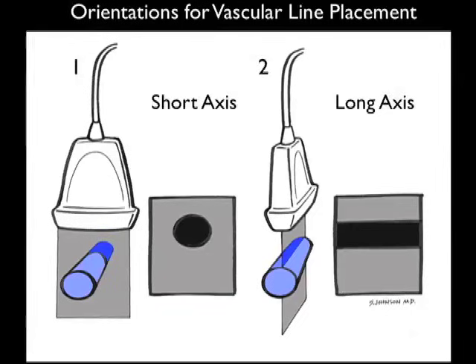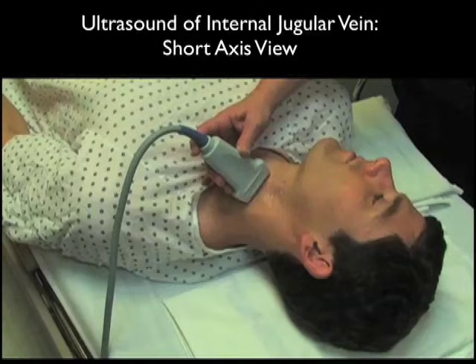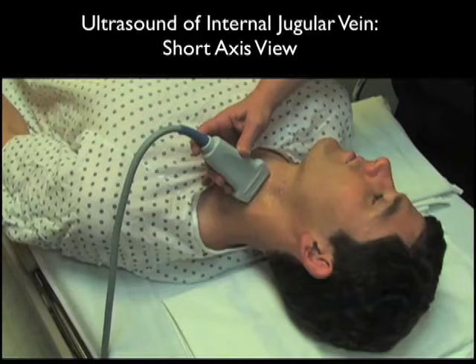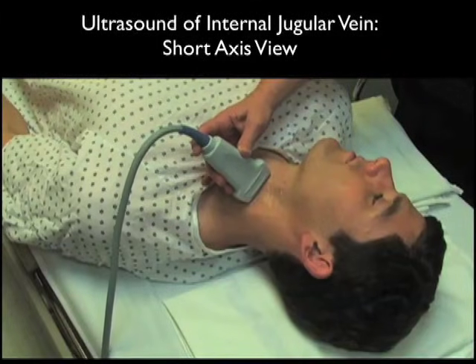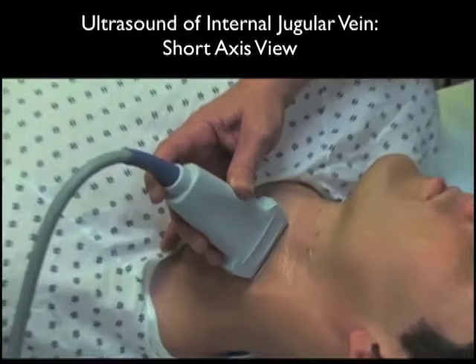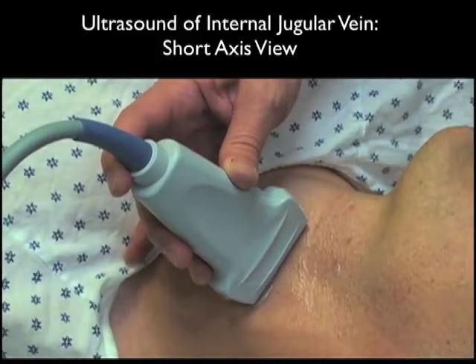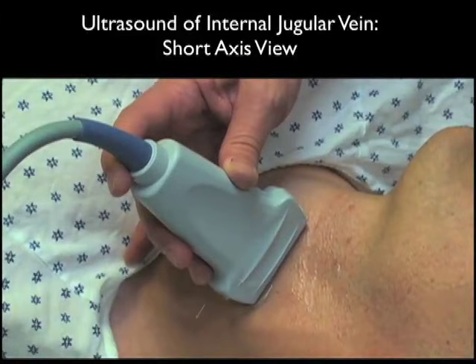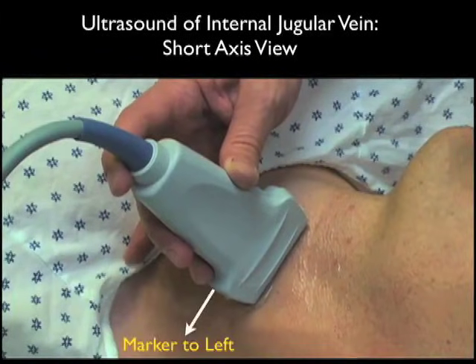The vessel, therefore, on the screen will appear as a tubular structure as shown here in the image to the right. Here's the high frequency linear type array probe placed over the middle triangle of the neck over the internal jugular vein and carotid artery. I like to have the probe positioned in a side-to-side orientation with the marker dot oriented towards my left as I stand at the head of the bed.